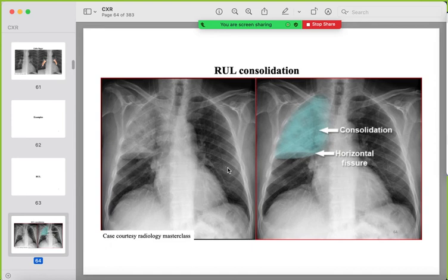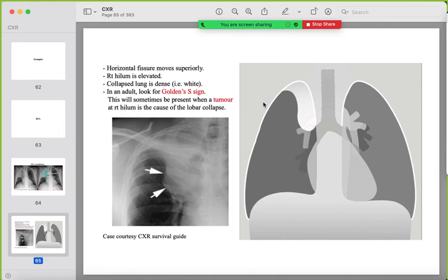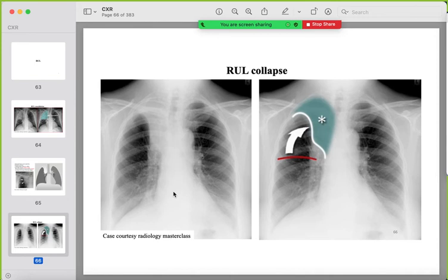Starting with the right upper lobe: know the difference between consolidation and collapse. Consolidation shows alveolar opacification with air bronchograms, no volume loss, no mediastinal or hilar shift. In collapse, the horizontal fissure moves superiorly, making a Golden S sign, the right hilum is elevated, and the collapsed lobe is dense. The Golden S sign also indicates a mass or tumor causing the collapse.